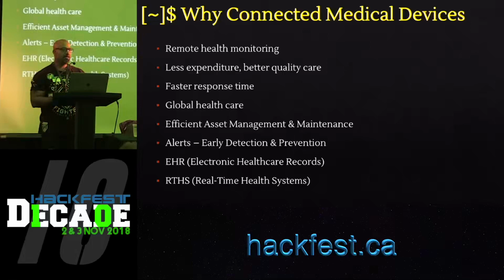We only looked at one device from one manufacturer. Also, this image is random as well. From the workflow perspective, the pen or the device would connect to the hospital network using wired or wireless protocols, and then it would take the information written by the doctors and transmit it over SSL to the application server, which also exposes data through a web portal. The web portal would allow patients to view their own prescriptions. There would be a login for pharmacies to gain access to the prescription, a login for manufacturers, and a login for medical practitioners to look at that data.